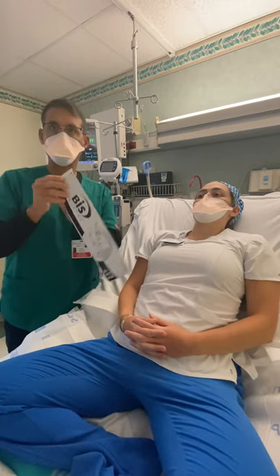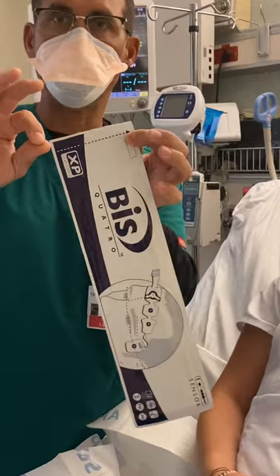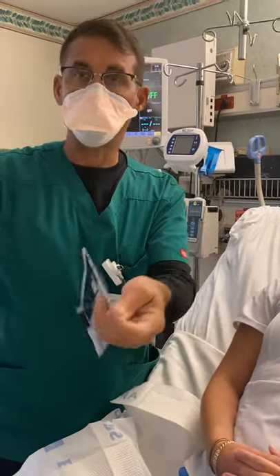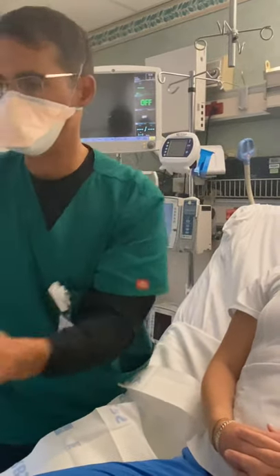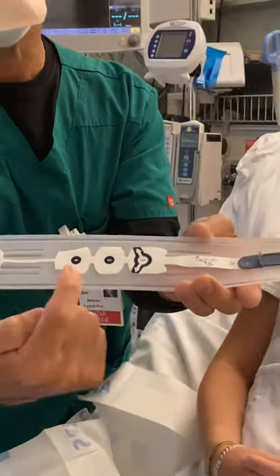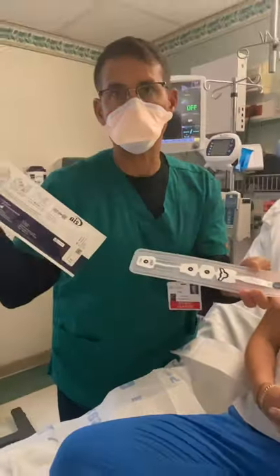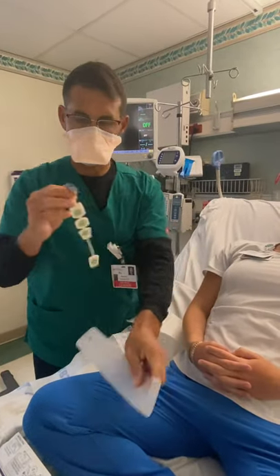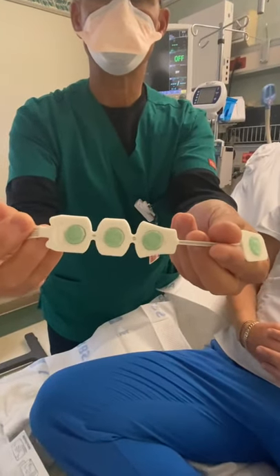Once that is dry, open your packet of leads. You see this little piece right here? You have to open it from the end, because if you open it here, you're going to rip it in half. You take it out, and it looks like this. It says 1, 2, 4, 3. Again, the packet is going to tell you where they go if you forget. You pull them off of here, and they have a little bit of gel behind each lead.